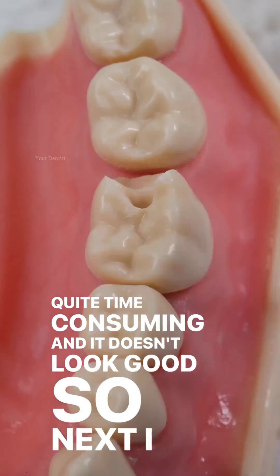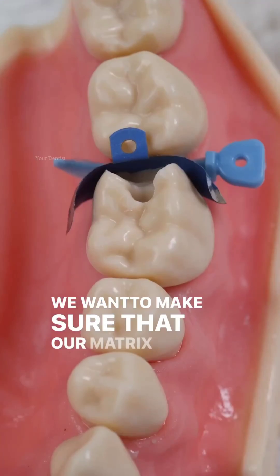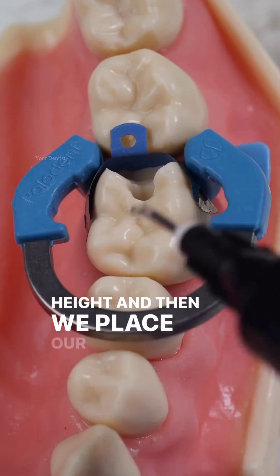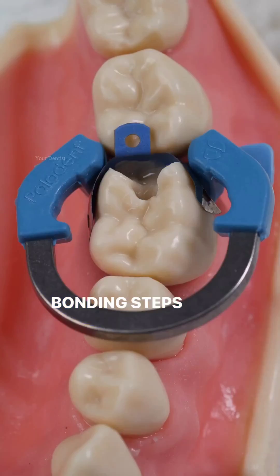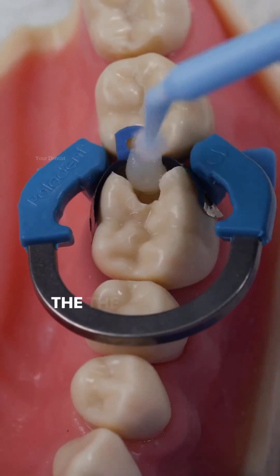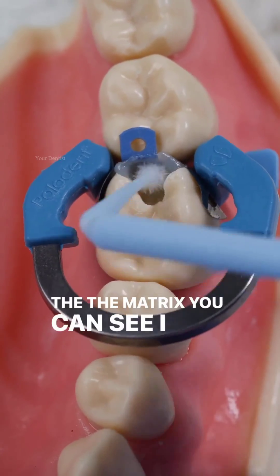Next I will demonstrate getting the ridge height correct. First of all we want to make sure that our matrix band is the correct height, then we place our wedges and ring and do all the bonding steps. Then when we do the first increment on the matrix, you can see I place a little bit.